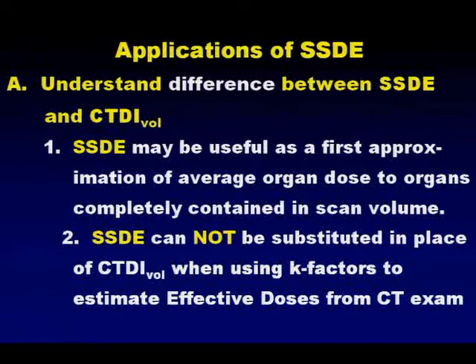SSDE cannot, do not, under any circumstance, substitute it for CTDIvol when you use the standard K factors to estimate the effective dose from a CT exam. All those K factors were established and published based upon either the CTDIvol from the 16 centimeter phantom or the 32 centimeter CTDI phantom. And so we cannot substitute SSDE for that.